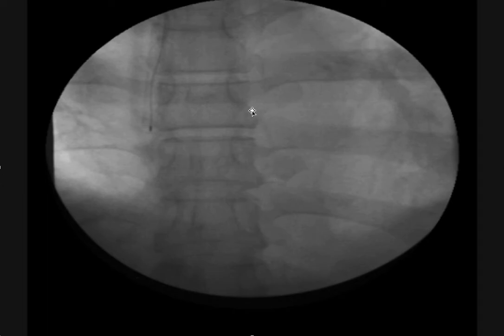What I do is typically, if possible, grab the lead from below, put tension on it from below, and then I have a wonderful rail and I can bring my powered sheath down to the point where the needle's eye snare is, then release the needle's eye snare and then continue with the rest of the lead. And what's nice about this is you don't get that hypotension with pulling on the lead, because your point of countertraction is actually with the femoral extraction system. I found that to be very helpful.